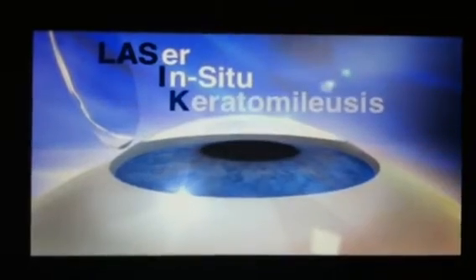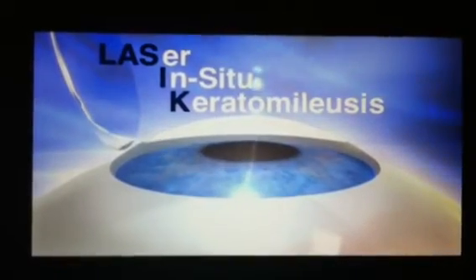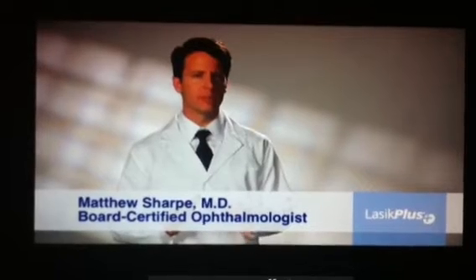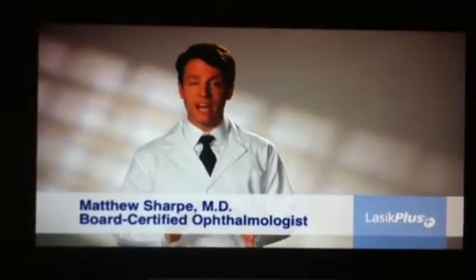What does LASIK mean? LASIK is short for laser in situ keratomileusis, which simply means to shape the cornea from within using a laser. In order for the eye to focus light clearly on the retina, the cornea must be of the proper curvature. If it's not, nearsightedness, farsightedness, or astigmatism can occur.